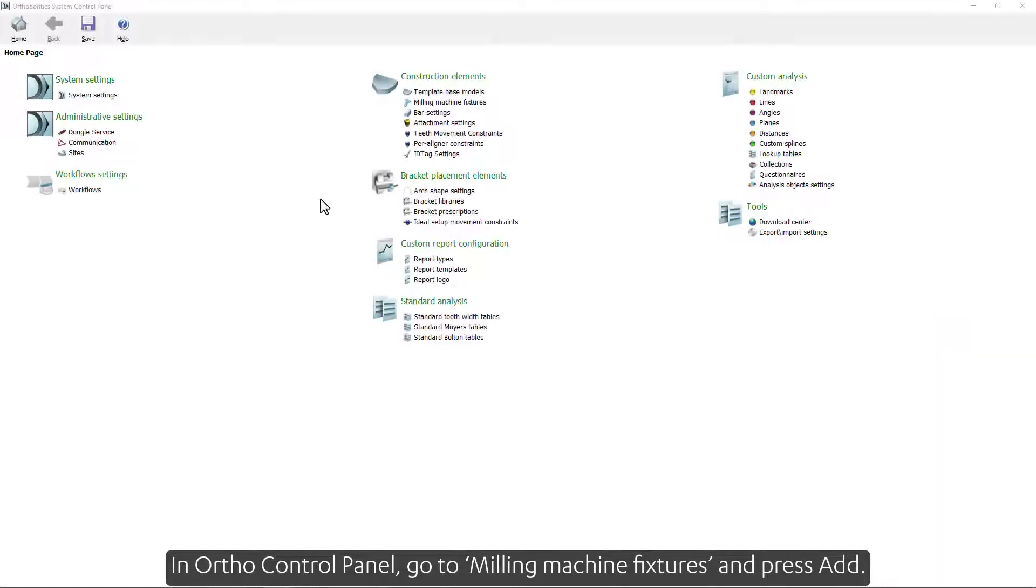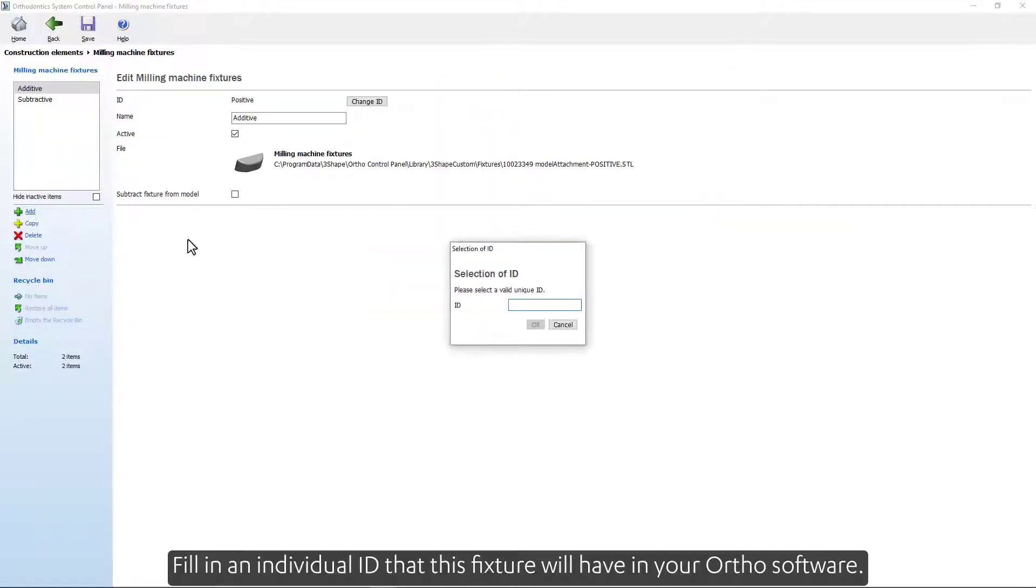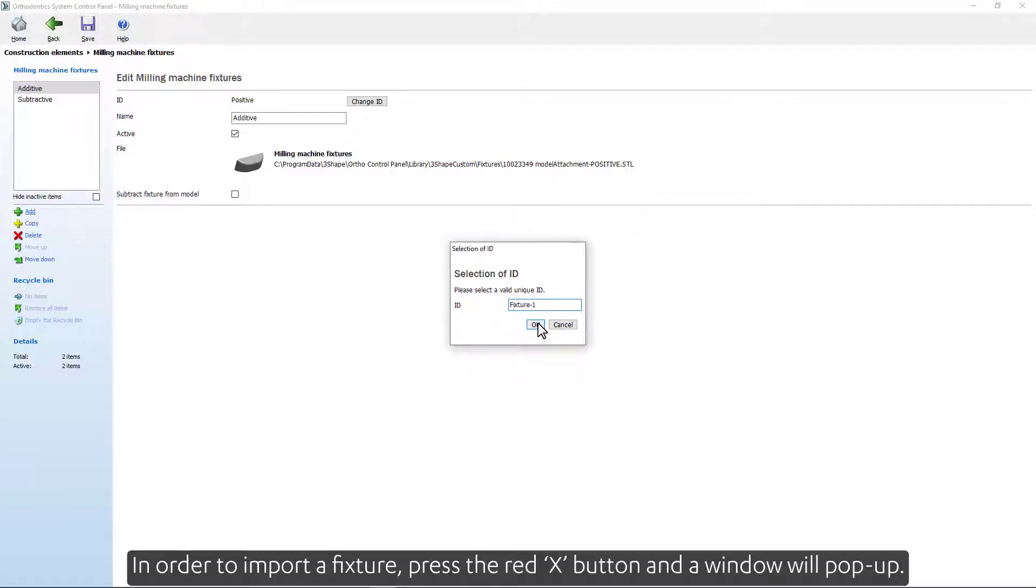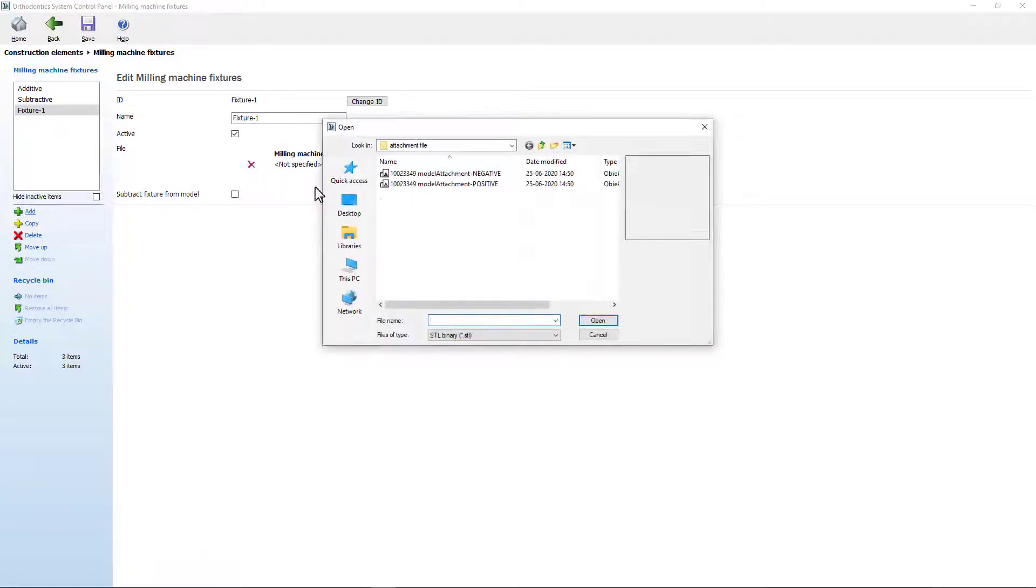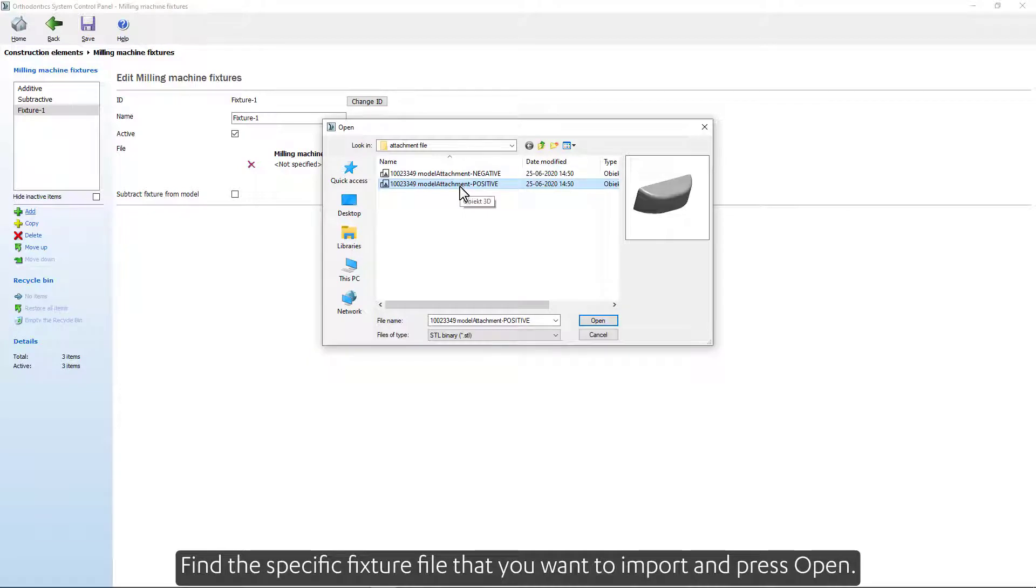In Ortho Control Panel, go to Milling Machine Fixtures and press Add. Fill in an individual ID that this fixture will have in your Ortho software. In order to import a fixture, press the red X button and a window will pop up. Find the specific fixture file that you want to import and press Open.